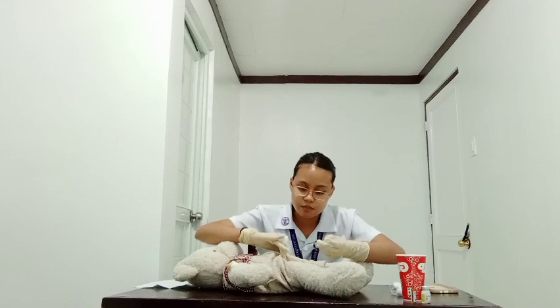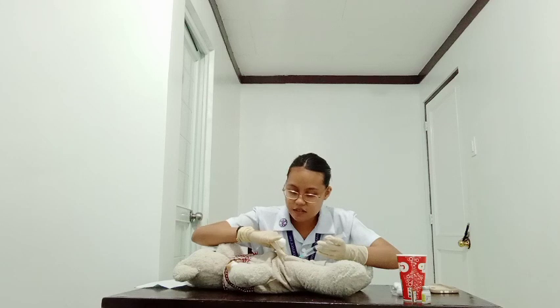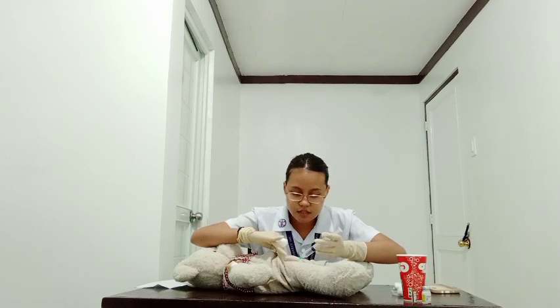So this is to prepare to inject. Using the non-dominant hand, pinch the skin or spread it at the side and insert the needle using the dominant hand with a firm, steady push. Pinching helps to pull the fatty tissues away from the muscle and makes the injection easier. So now, I will insert it, ma'am. Okay.